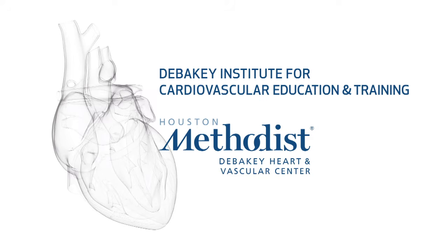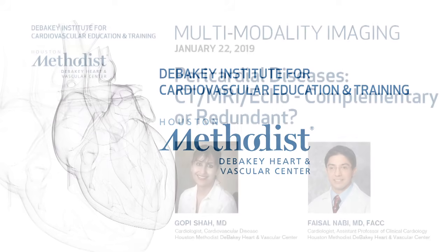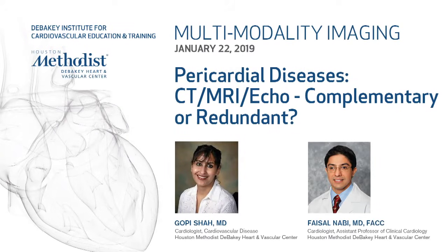Good afternoon and welcome to the talk on pericardial disease. The first half will be on echo and the second half will be on the CT-MR's role in pericardial disease.